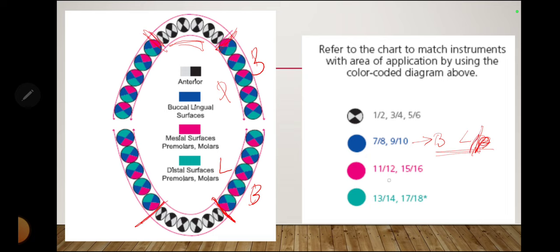Gracey curets 11-12 and 15-16, shown in pink, are for the mesial surface of posteriors. Gracey curets 13-14 and 17-18, shown in green, are for the distal surface of posteriors.